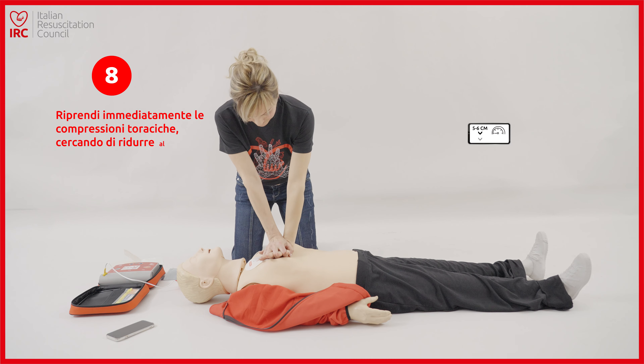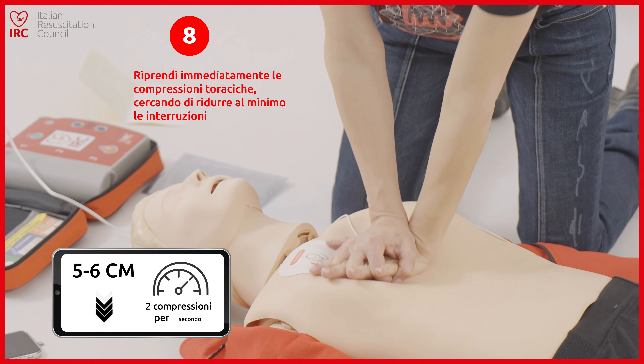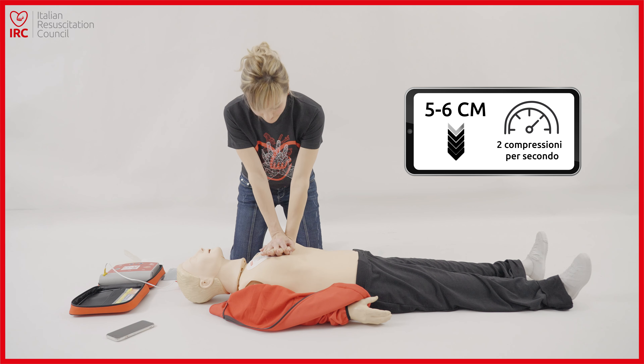Scarica effettuata. In pausa. Se necessario iniziare la rianimazione cardiopolmonare.